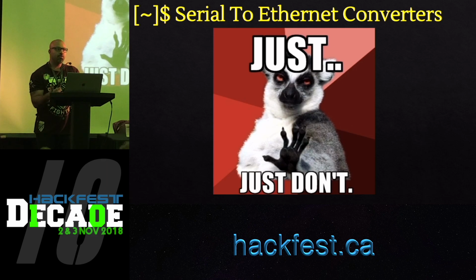One was that it would allow an attacker to extract sensitive information from these devices remotely and unauthenticated. The other would allow an attacker to upgrade or downgrade the firmware on one of these devices, also remotely, also unauthenticated. And as if that was not enough, there was also a buffer overflow vulnerability that would allow an attacker to execute code remotely without any authentication. So generally a bad idea.